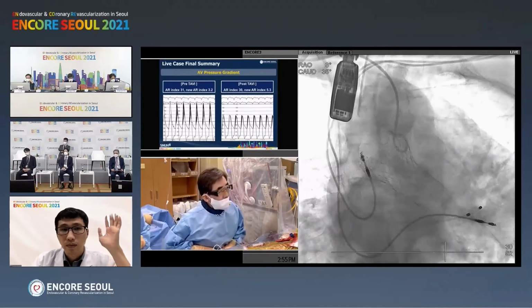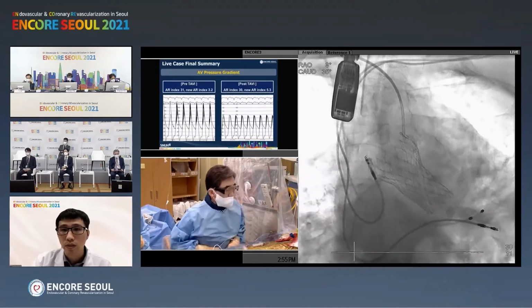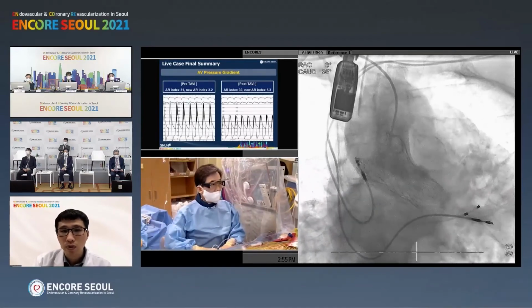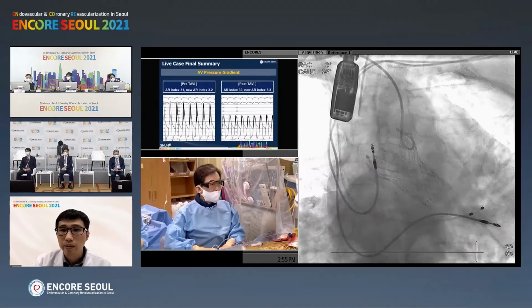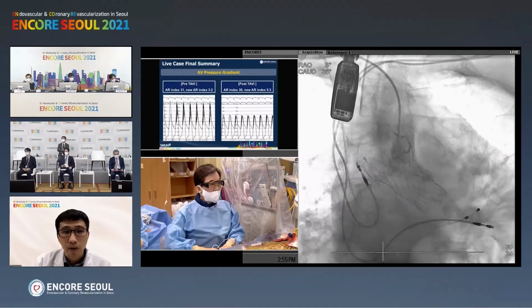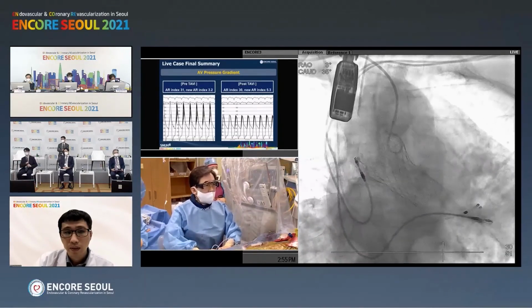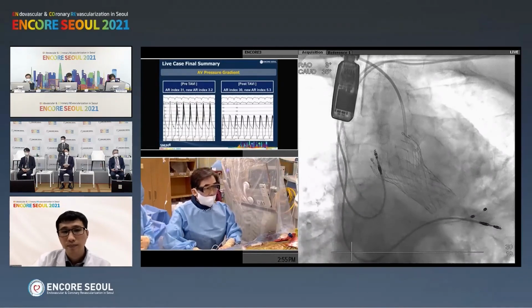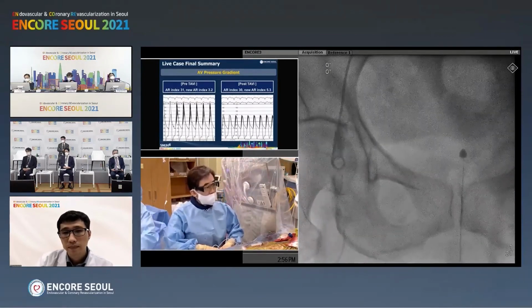Okay, Dr. Lee, Cheon Lee. Thank you for your excellent case and good results. Simple question. In this case, the right femoral puncture is at a slightly acute angle. When puncturing the femoral artery where the main device will enter, do you prefer sono-guided puncture or roadmap angiography guided puncture in TAVI? No, we just follow the traditional fluoroscopic angio-guided puncture. But we all acknowledge the three-dimensional course of the common femoral artery by pre-CT angiogram.